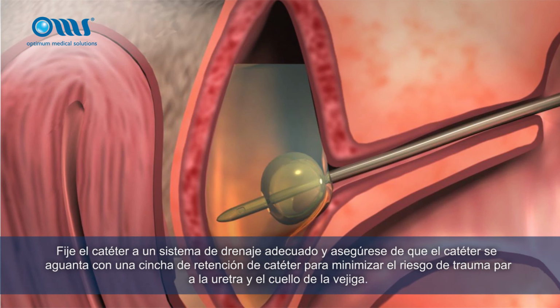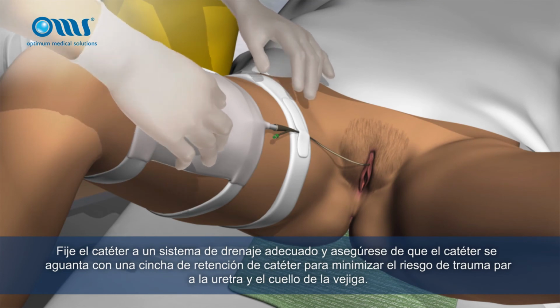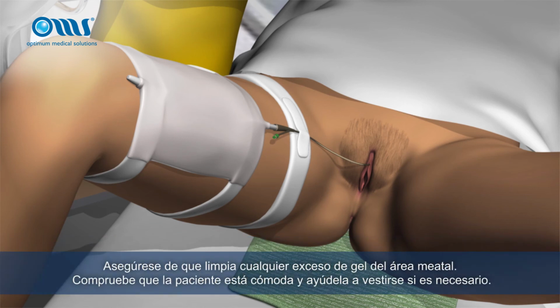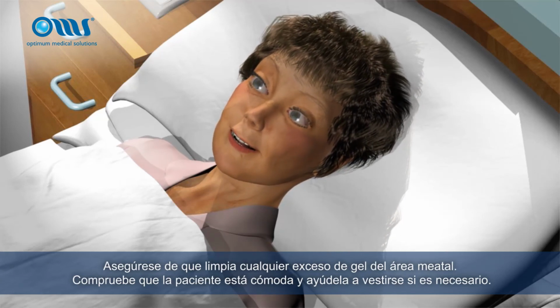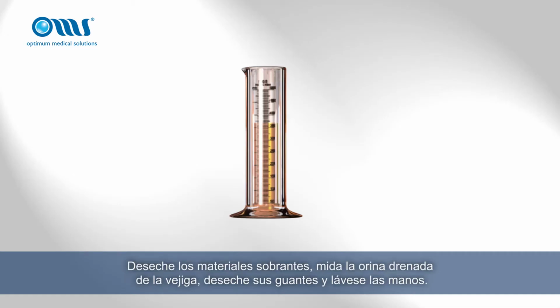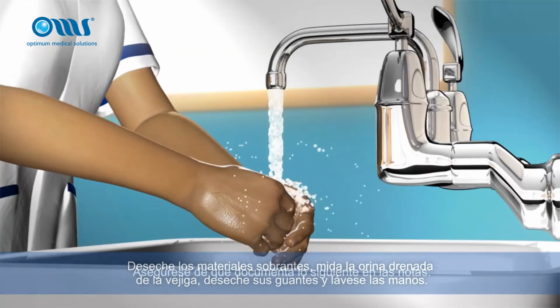Attach the catheter to a suitable drainage system and ensure the catheter is supported with a catheter retaining strap to minimise the risk of trauma to the urethra and bladder neck. Make sure you clean off any excess gel from the meatal area. Check that the patient is comfortable and help get them dressed if required. Dispose of the waste materials, measure the urine drained from the bladder, dispose of your gloves and wash your hands.